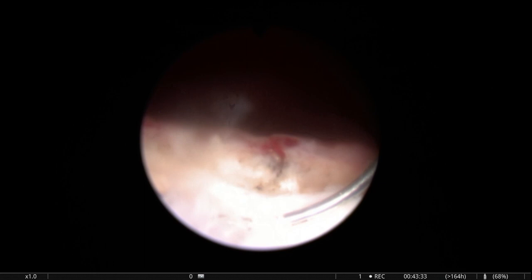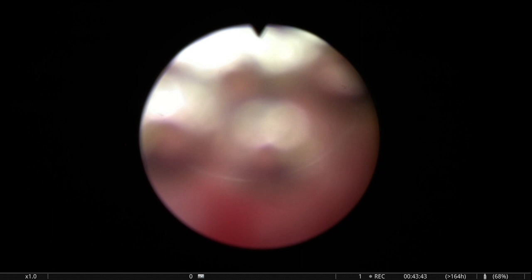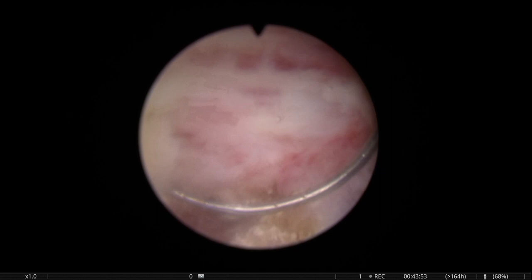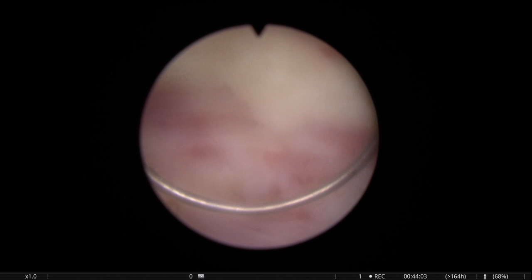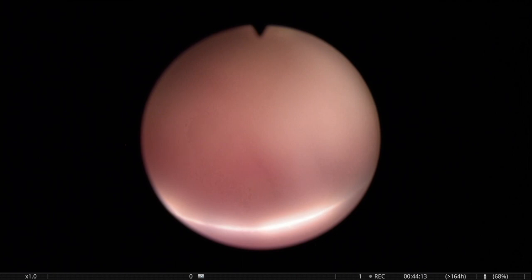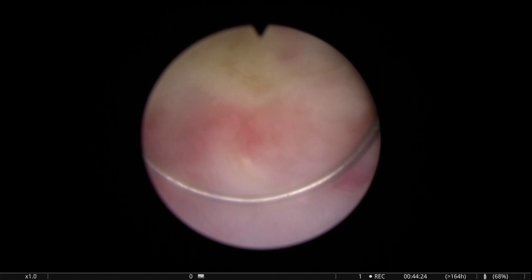And these bleeders often are looking towards the bladder. And when you go in with the laser fiber, you don't get to see them so easily. So sometimes this final check with a resectoscope is helpful. And it reduces the amount of postoperative bleeding. Probably if we put a catheter, the bleeding will be there for some time and then it will subside. But as I said, we try to be as thorough as possible to prevent bleeding postoperatively. If there is bleeding postoperatively, I think it's imperative to go back to the operating room, not let the patient bleed. Sometimes you think, if I wait, maybe it will subside. But if you see bleeding that is abnormal, I think act early.